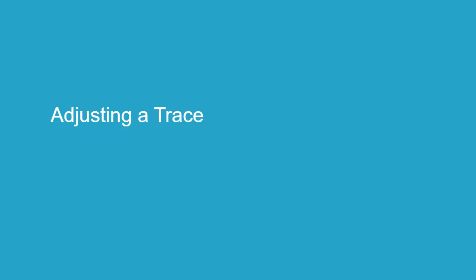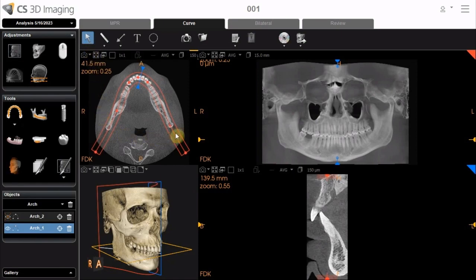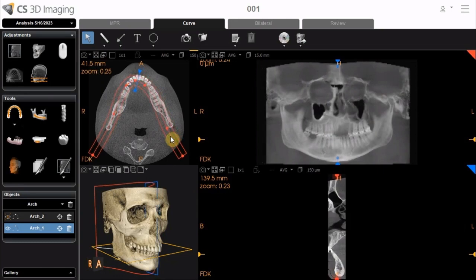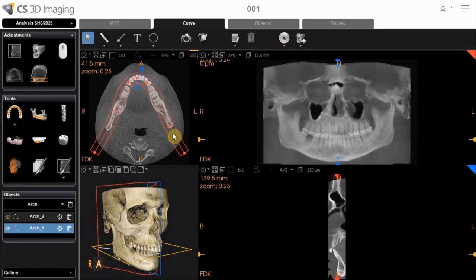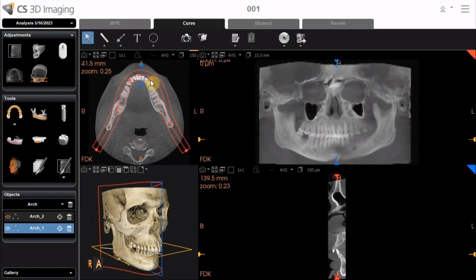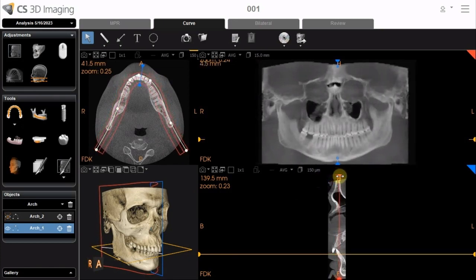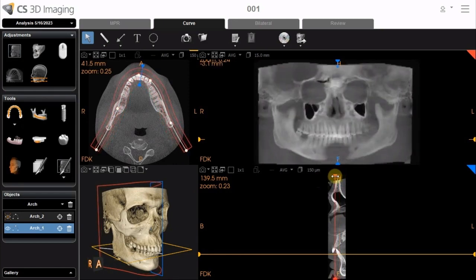Adjusting a Trace. To adjust the position of a trace, activate Select Mode. In the Axial Slice View screen, click and drag directly on the red line to move the entire trace. Or, click and drag an individual control point to adjust part of the trace. You can also adjust the position of the trace by using the red handles in the cross-section view, or by using the mouse scroll wheel function.